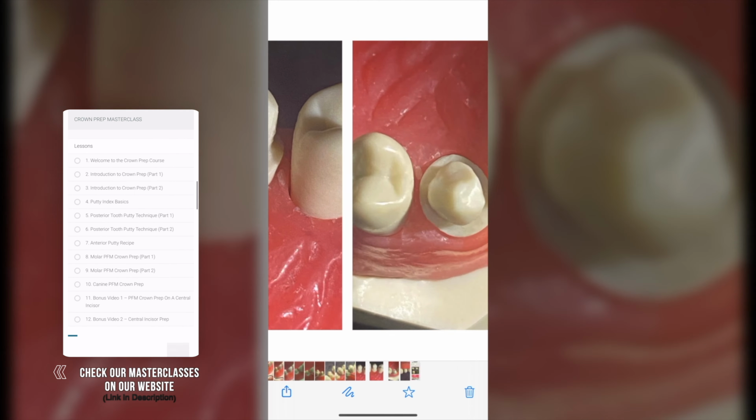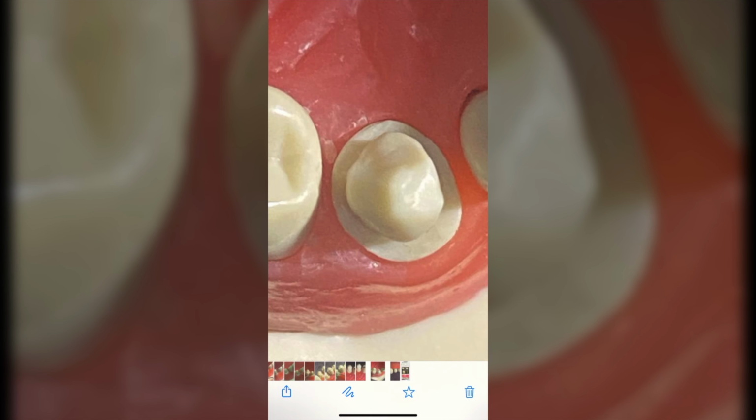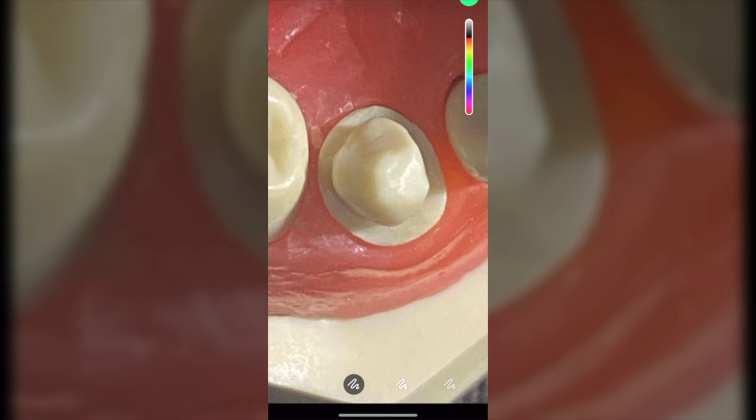I can guarantee you that this prep was done under the influence of using a putty and not a depth groove, because I feel like you've relied so much on the putty that the whole measurements have gone wrong. Review the video again and the importance of depth reduction. Why is it important? Why do I keep saying a tooth structure never lies? A putty is not an accurate tool.